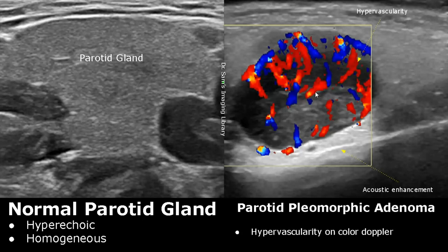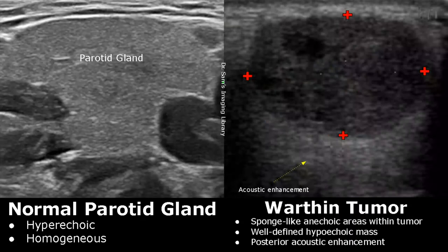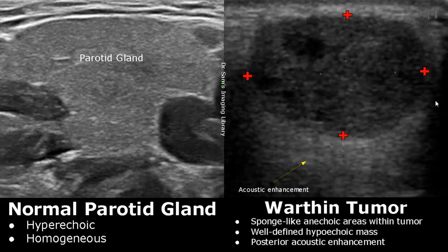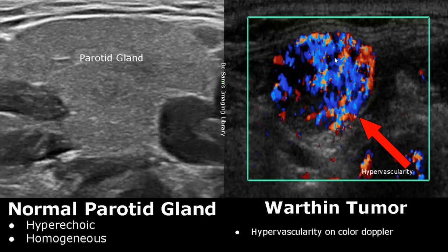Warthin tumor is the second most common salivary gland tumor. The appearances overlap with pleomorphic adenoma, but one distinguishing feature is that it contains sponge-like anechoic lesions. Other features are similar, such as a well-defined hypoechoic mass with posterior enhancement. A Warthin tumor is also hypervascular on color Doppler and will contain numerous Doppler signals.